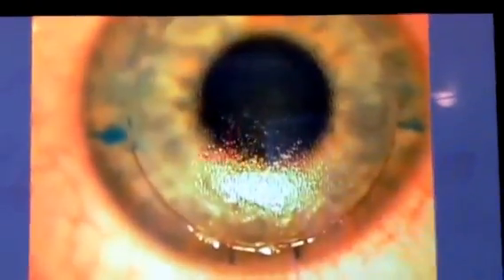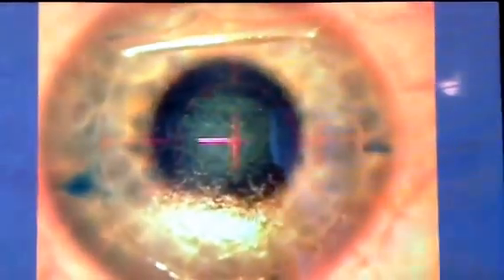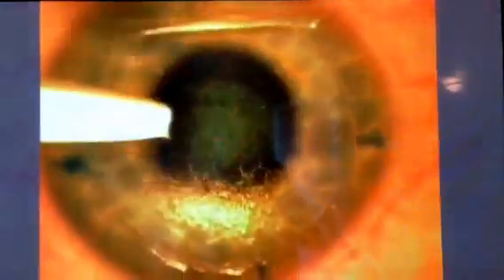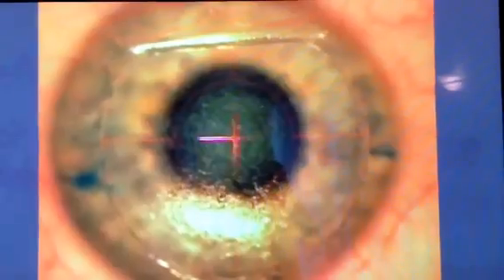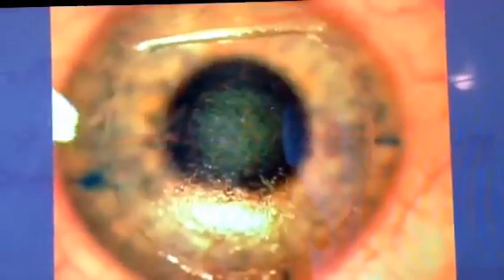They'll pick it again, so we know exactly how many microns that was. Now he's going to do a laser. He usually smooths it out too. He didn't like something in there.